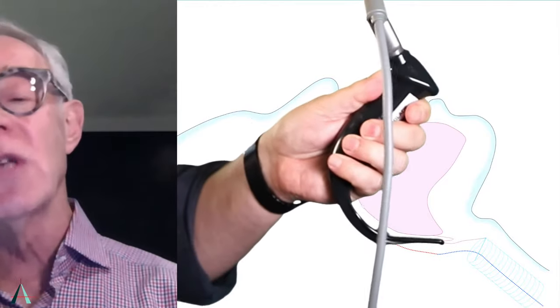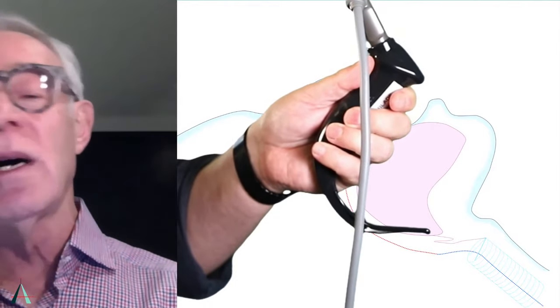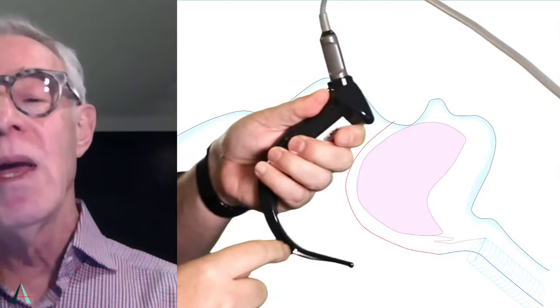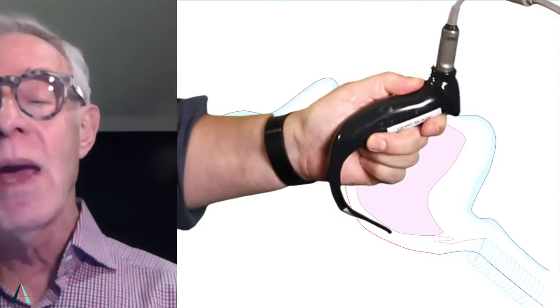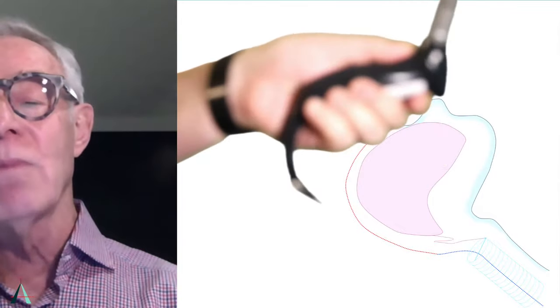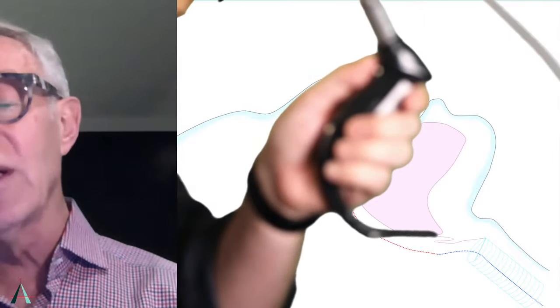What I'm going to ask you to do is imagine, first of all, you would be applying a slight film of a water-soluble lubricant along the blade so that the blade sweeps smoothly across the tongue without pushing the tongue back. Then rotate the laryngoscope around the base of the tongue. And once you get to the base of the tongue, stop. Now, let me just do that again for you, at the base of the tongue, until the distal aspect of the laryngoscope blade is more or less parallel with the floor. Perfect. That's exactly where I'd like you to be.